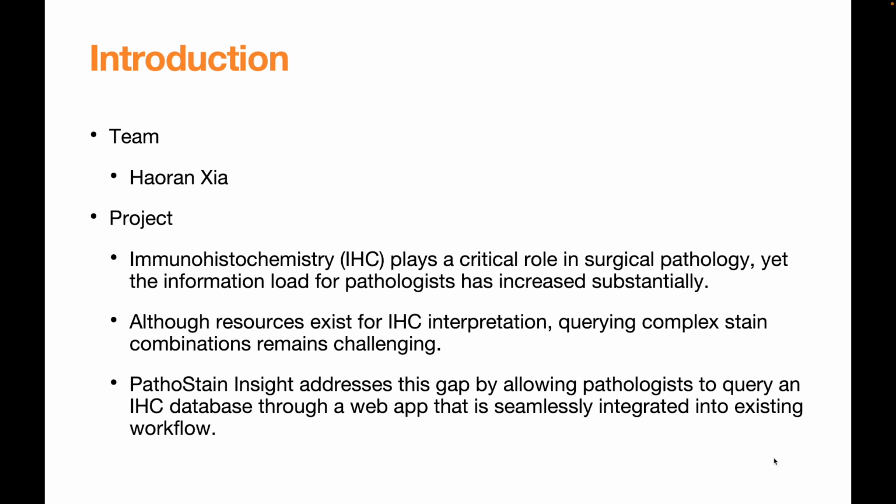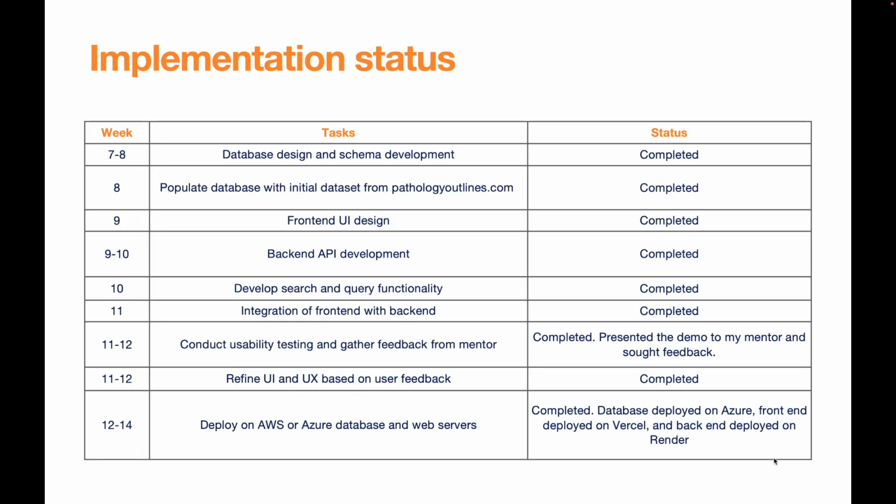PathoStain Insight allows pathologists to query an IHC database through a web app that is seamlessly integrated into existing workflow. Next, let's look at the implementation status. Here's a table summarizing all the tasks that were designed at the beginning of the semester. As we can see, all of them have been completed, so there's no pending task.